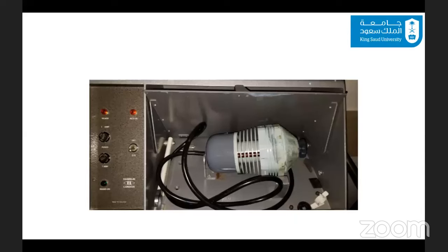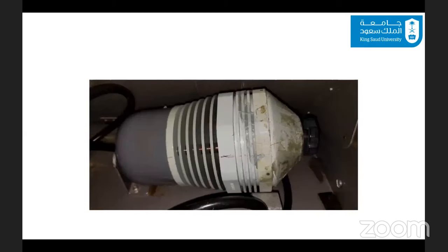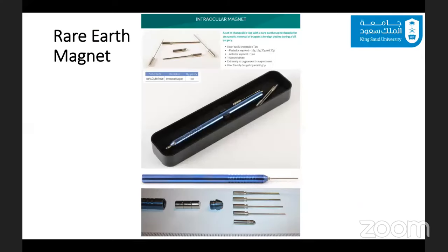Now we have this giant magnet. Usually you need to hold it with both hands, and the beauty of it is that you can hold it at whatever angle or direction you want to choose, in order to line the axis of the power of the magnet in line with the wound and the foreign body, thus reducing injury to other parts of the eye.